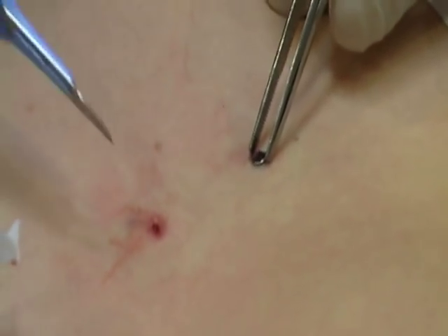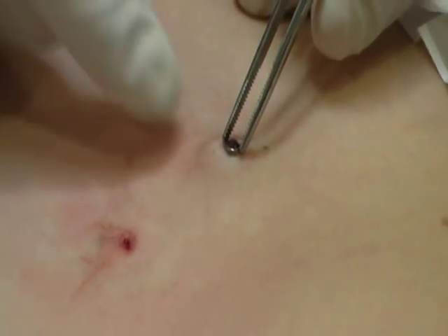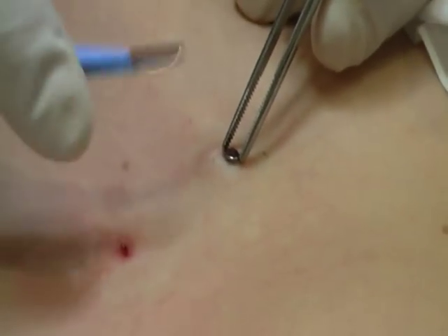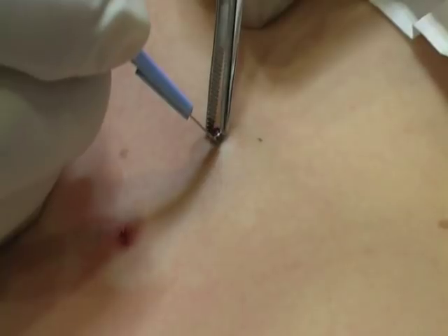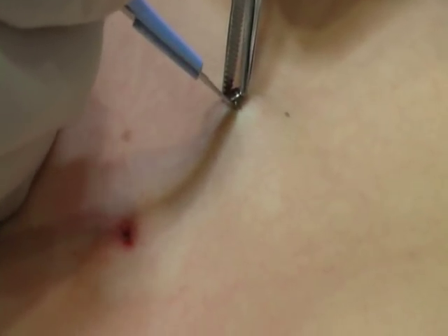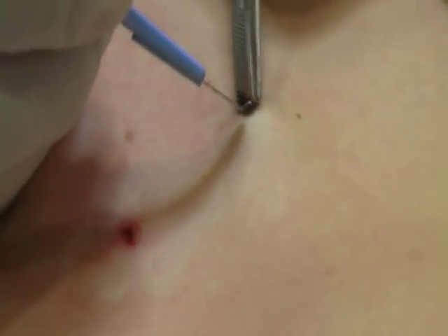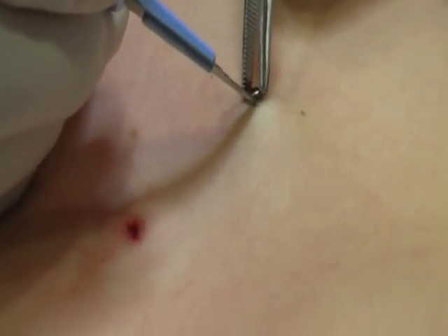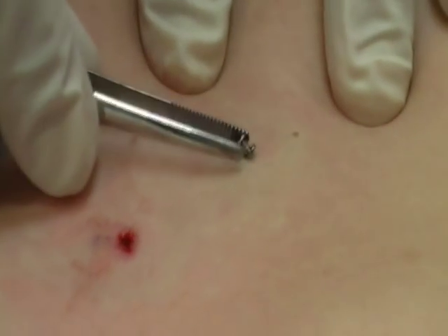Having seen what the first one looks like and how big the base is, I'm now lifting this one up here and I can actually see that just here is where the main part of the base plate is. So the shorter part of the base plate is that side. So what we now know is what we're dealing with underneath the skin. I'm just making a little incision under there, and then once again I'm going to hopefully flick that out again. There we are — that one came out even easier, much more easily.